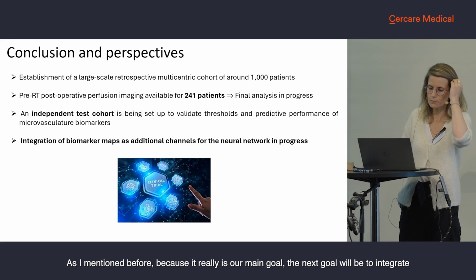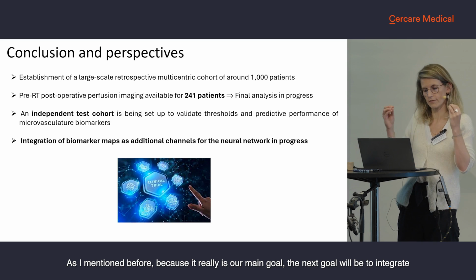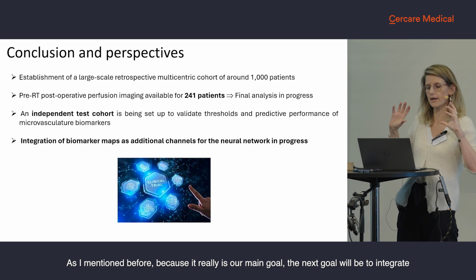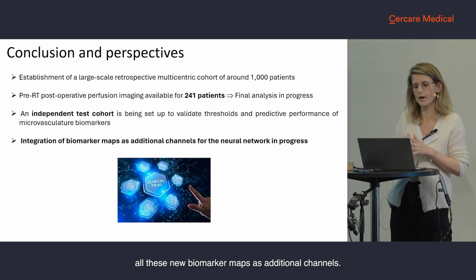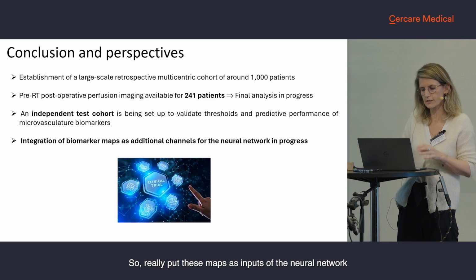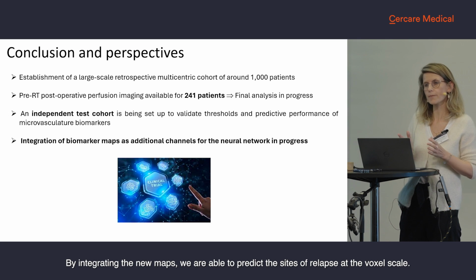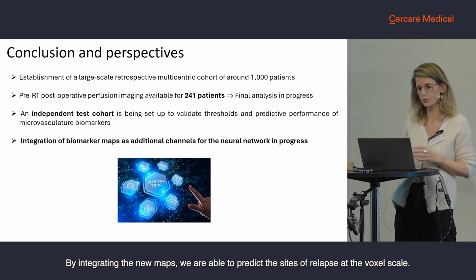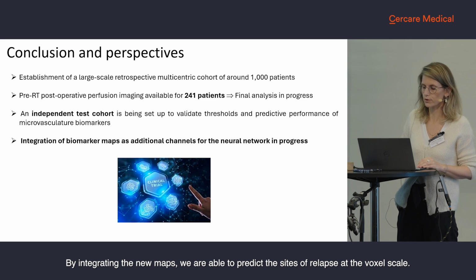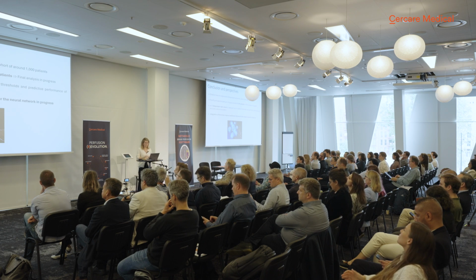And as I mentioned before, because it was really our main goal, the next goal will be to integrate all these new biomarker maps as additional channels, so really put these maps as inputs of a neural network in order to see if, by putting these new maps, we are now able to predict at the voxel scale the sites of relapse. So thank you for your attention.